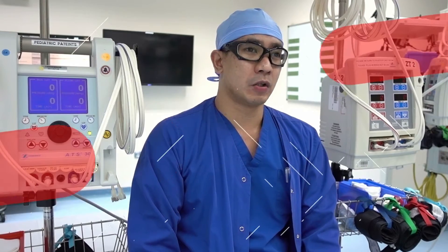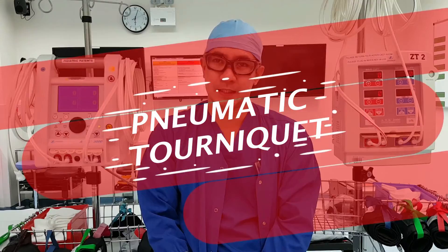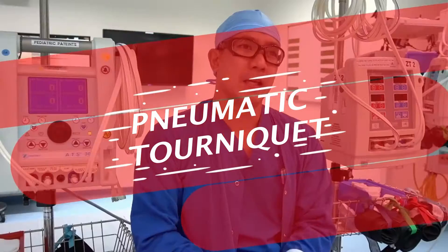Hello, what's up guys, it's me Cesar, your operating room nurse, and welcome to this operating room educational video. Today we're going to talk about pneumatic tourniquets like these two beside me, and of course how to apply one on our patient.